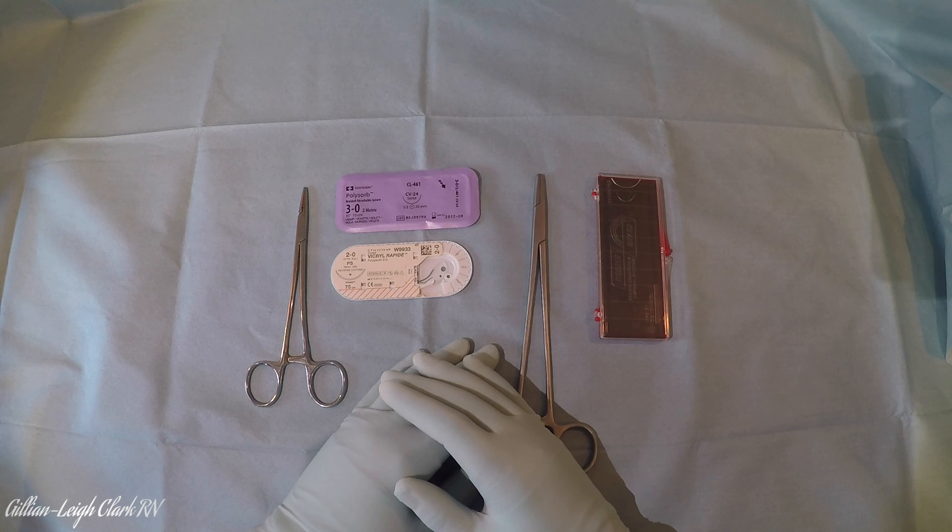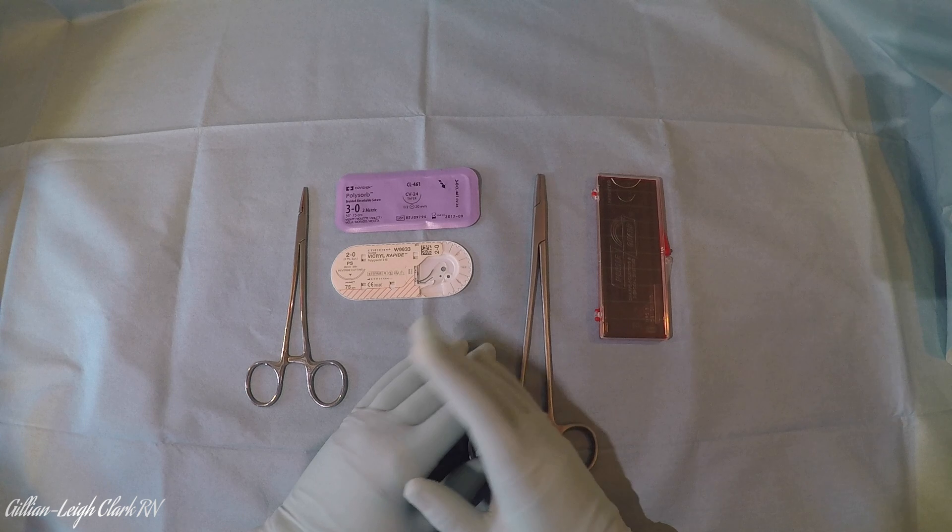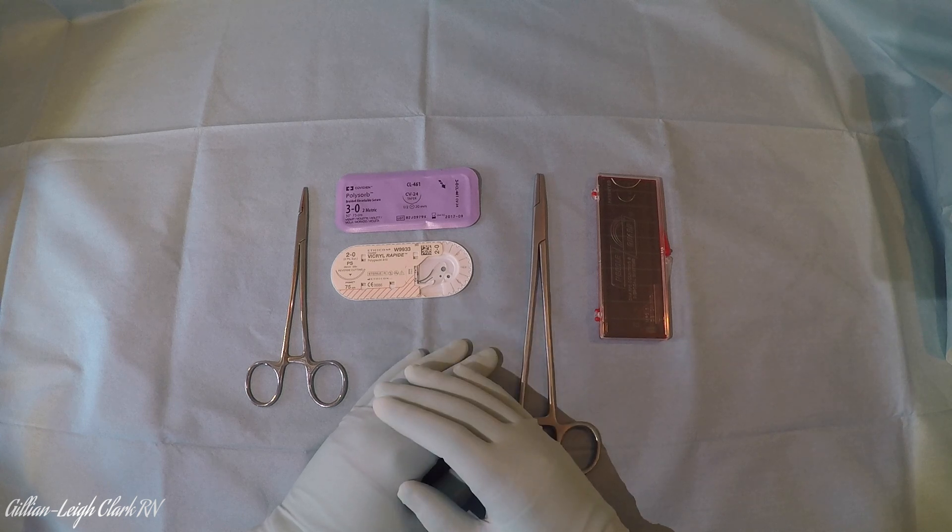Importantly, we want to make sure we're using the right size of needle holder for the right size of suture and needle. The needle is actually the sharp bit and the suture is the material attached to it, but we'll just call them sutures - it makes it easier for everyone to understand.